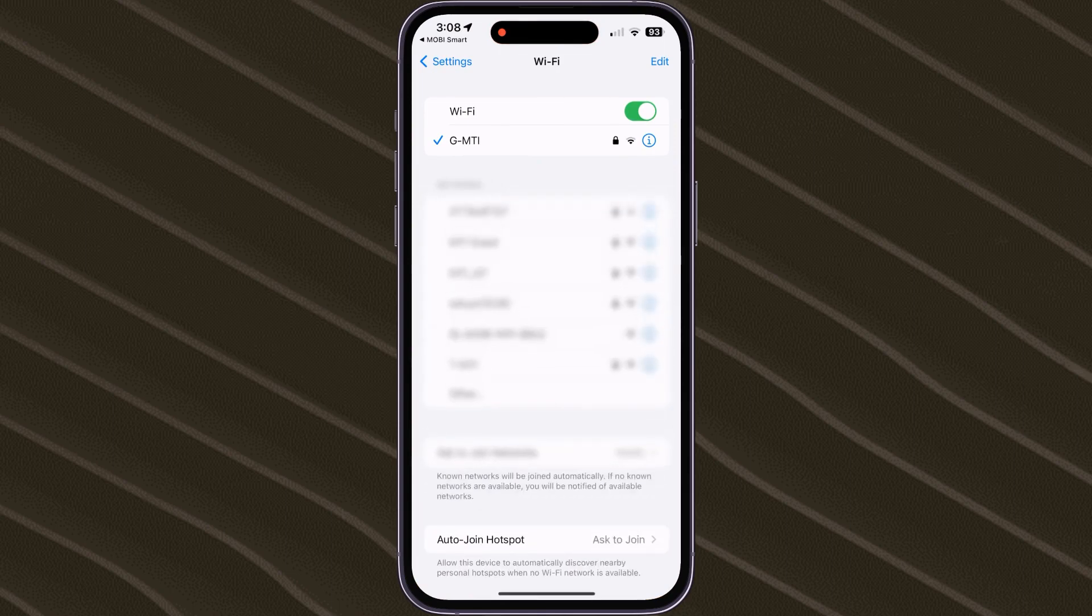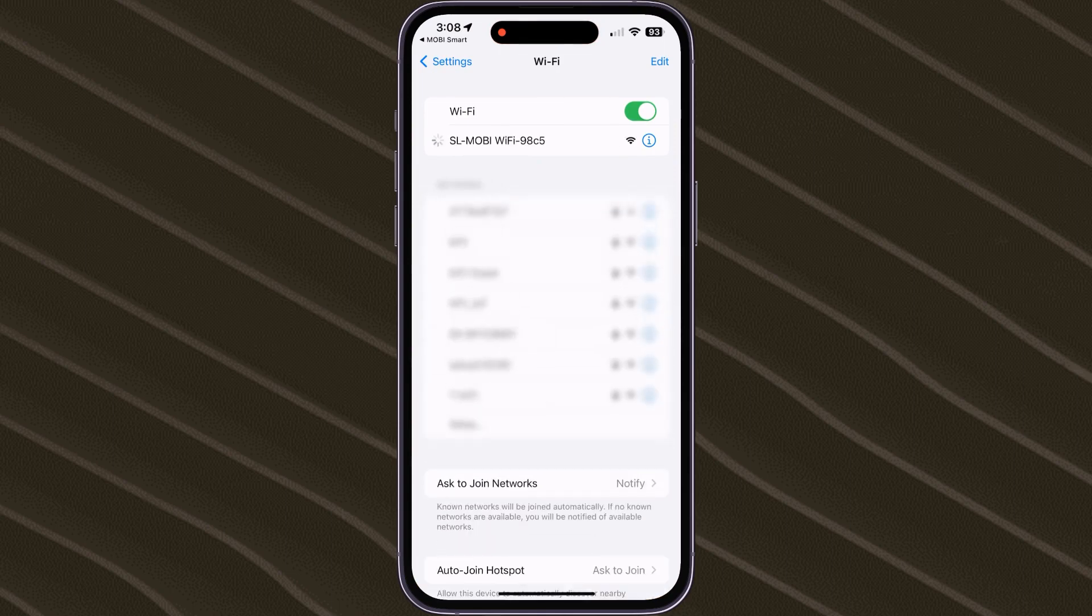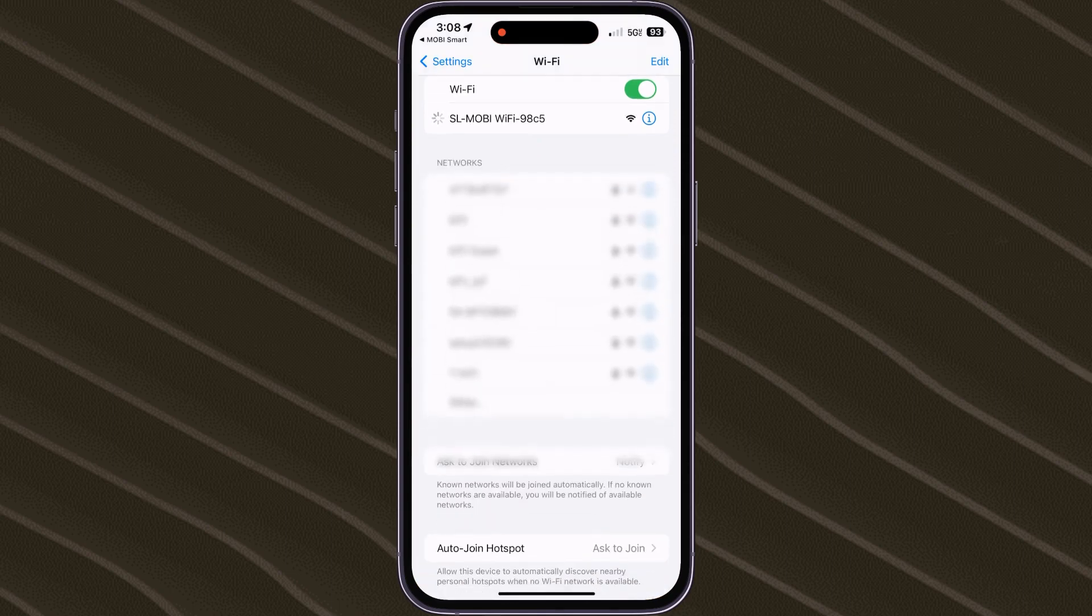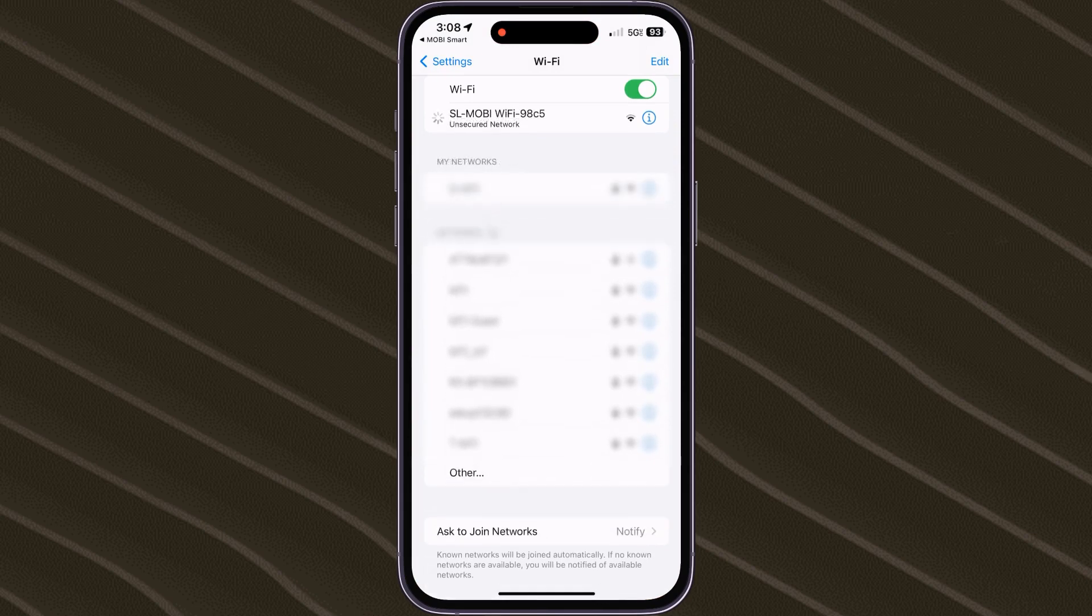By doing so, the app will take you to your smartphone's Wi-Fi settings, where we will look for and connect to SL Mobi.